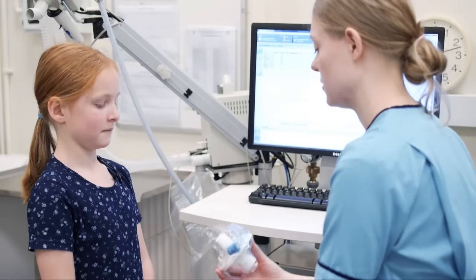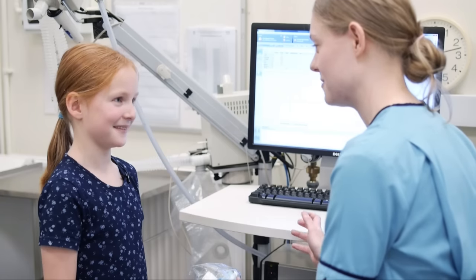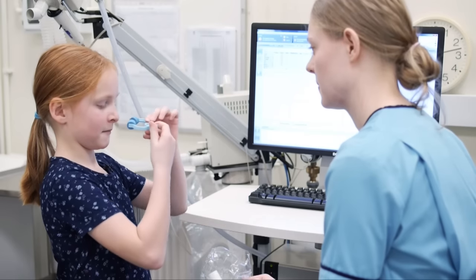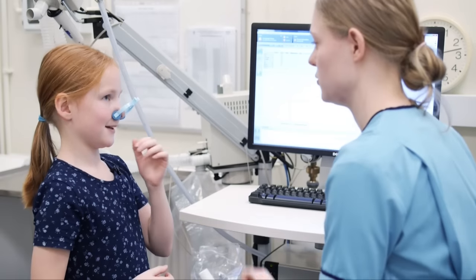So this is the mouthpiece that we use to do all our tests, Susan. What we do is we get people to put their lips and teeth around there nice and tight, but we don't like them to put their tongue too close to the opening, just in case the air comes out funny. And then we get them to wear a wee set of nose pegs on their nose so that all the air goes into the machine and none of it escapes out into the room. Would you like to try the nose pegs now? So if you squeeze the top bit, then you can put that bit on your nose. There we go, and we'll just get them pointing up the way so you don't bang your nose when you go onto the mouthpiece.